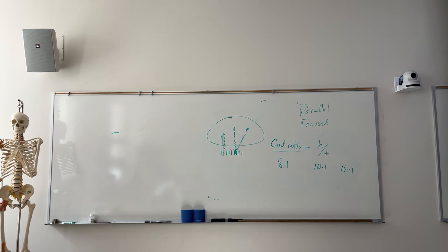It's a critical thinking question of the day. Why is the Bucky factor higher at 120 kVp? Because you create more scatter. And the purpose for the grid is to clean up scatter, right? So as kVp increases, the grid becomes more effective, right? So could you increase your kVp to compensate for grid use?